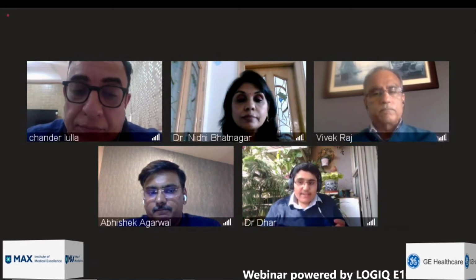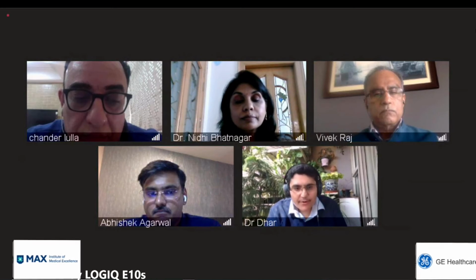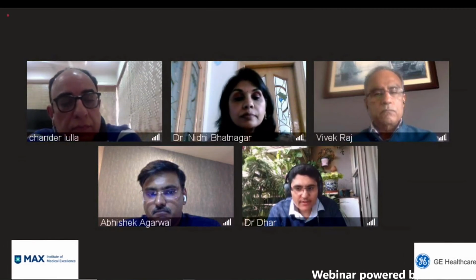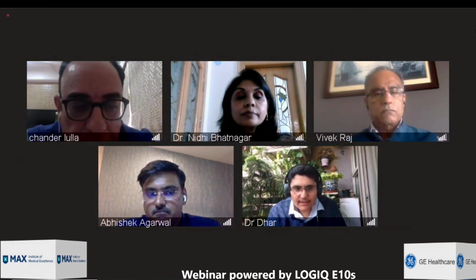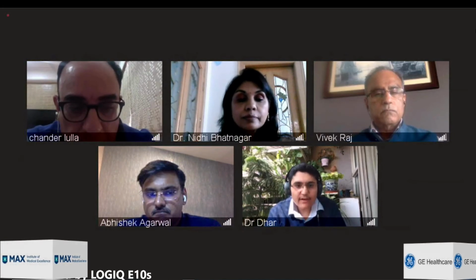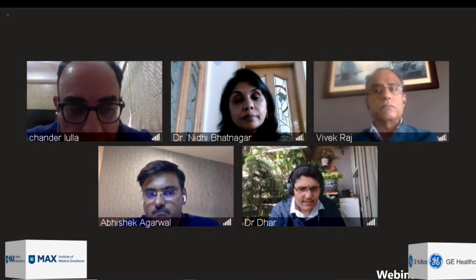So may I also interject here? I would say that when somebody comes for a risk assessment, it's more to do with the functional element of the liver rather than the structural problem. Elastography basically tells me what's wrong with the structure. It doesn't comment on the function, right? So I agree with Dr. Raj that even in my assessment, I would not give a lot of credence to elastography. I would want to look at the clotting factors, the ascites, the encephalopathy history, bilirubin, the CTP score basically.